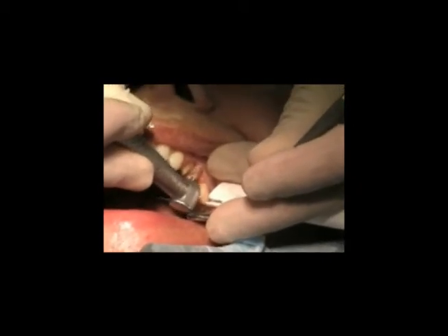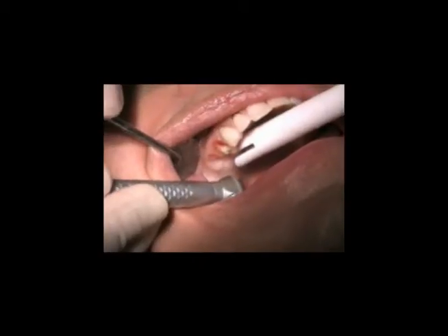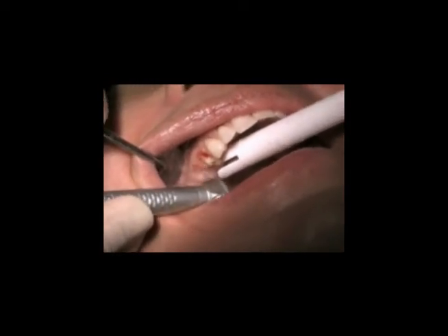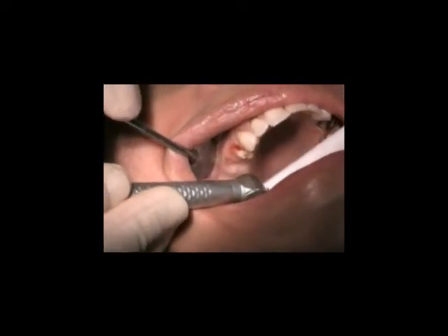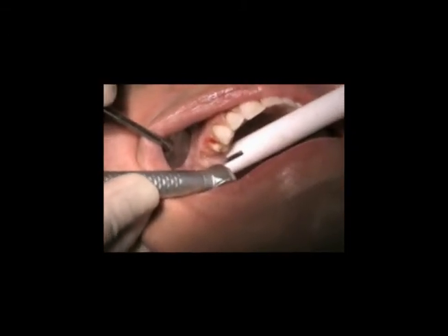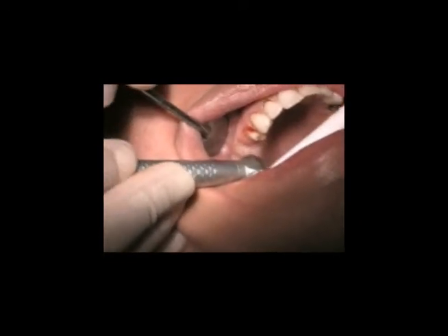It's a cold cut laser with a 2780 nanometer wavelength, and it's shown here making ovate pontics in the fibrous tissue. A diode laser can't even do this on ovate pontics because it won't cut deep enough into a heavy fibrous tissue area.